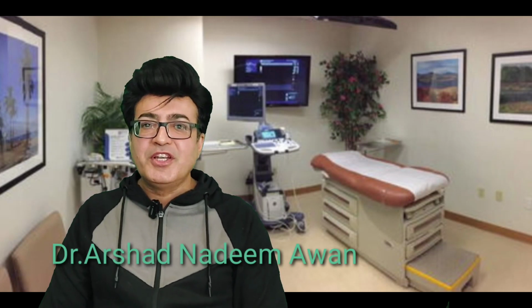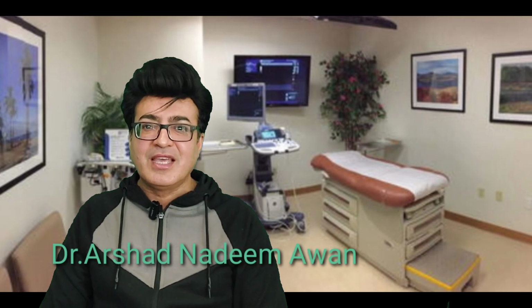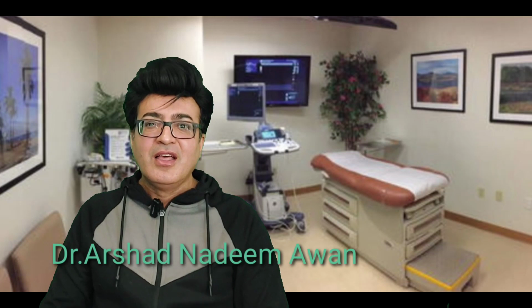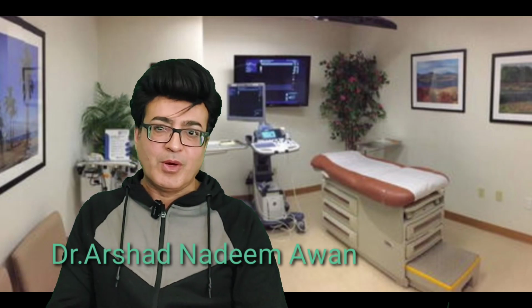So with respect to different cysts and their surveillance scan, their follow-up scan, and what next modality and what are the differentials, this video will be all about that. I will discuss the liver cysts: what would be the pattern to carry out this scan as a follow-up scan or as a surveillance scan, what would be the next modality, what we will advise on the report, and what would be the logical differential. And after that I will also discuss the adnexal cyst.